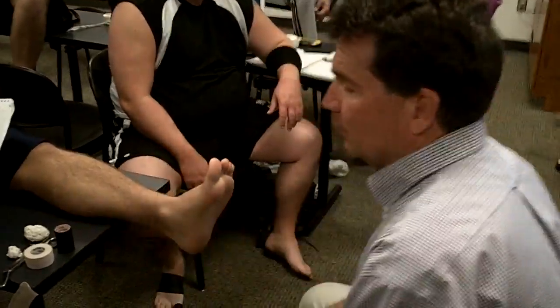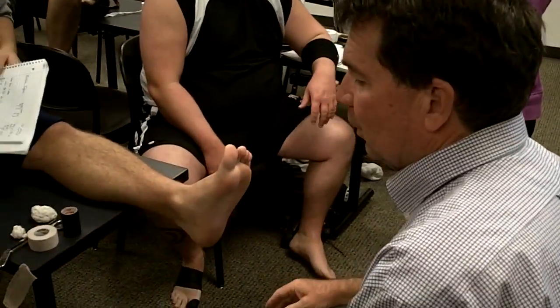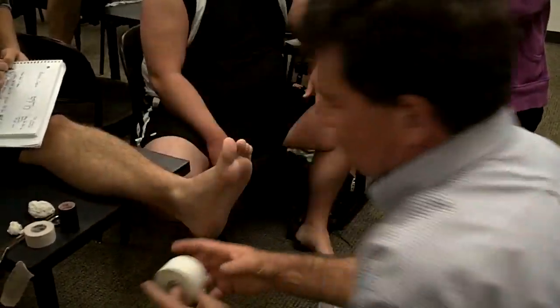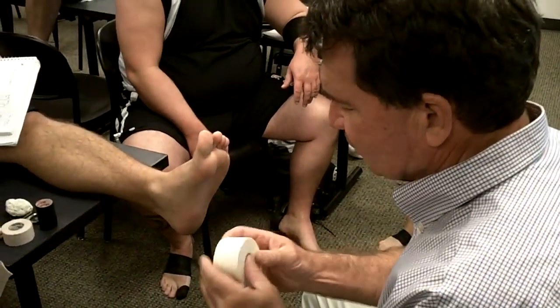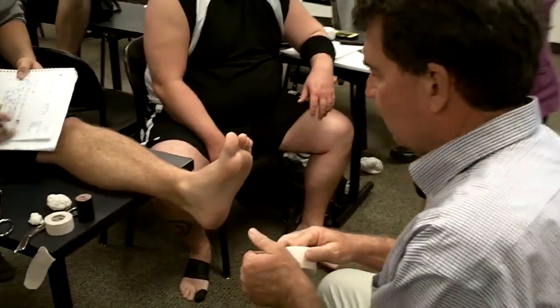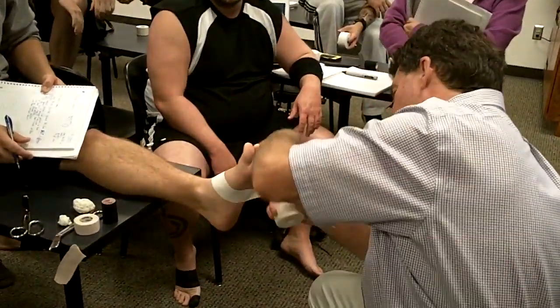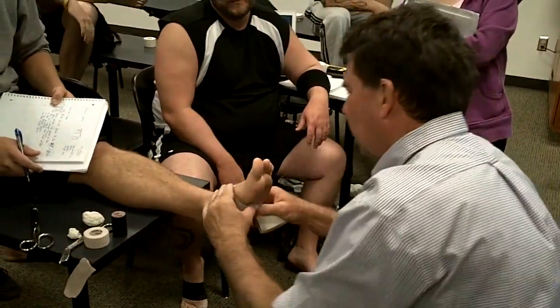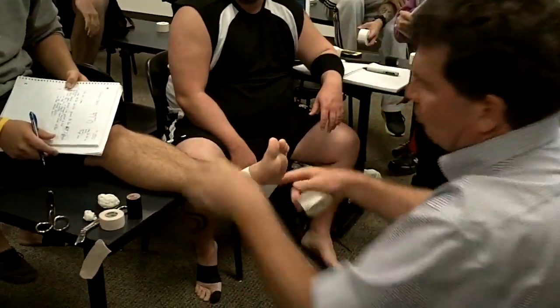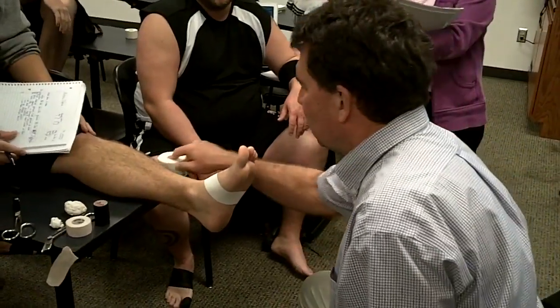I'm going to spray the foot. You can put a mid-foot anchor on if you like. You can use a non-elastic piece of tape and not close it — right through the arch and just bring it like so, if you wanted an anchor to make it hold better, because maybe it was slipping even though you were using the sticky spray.